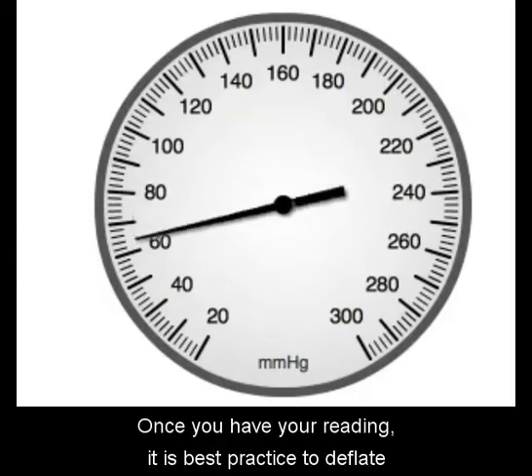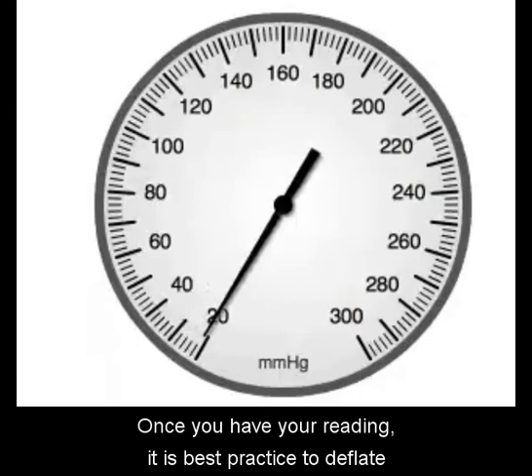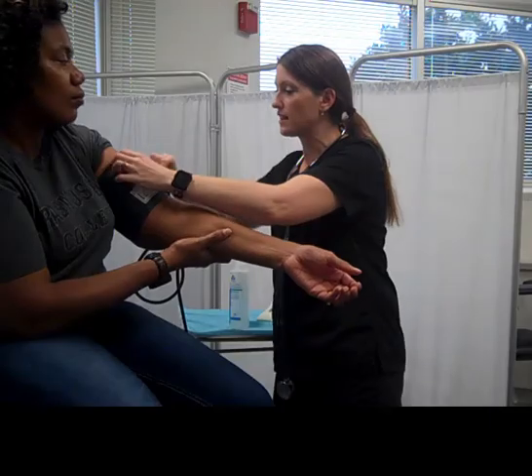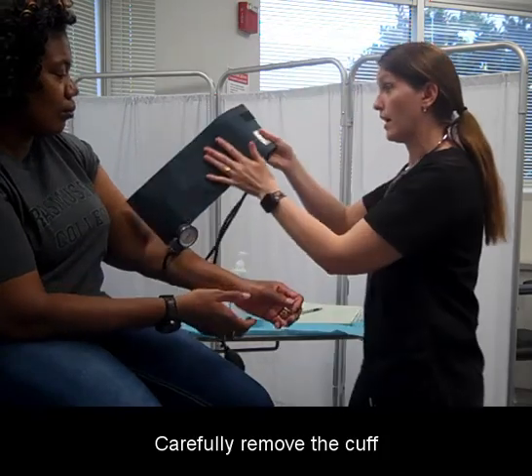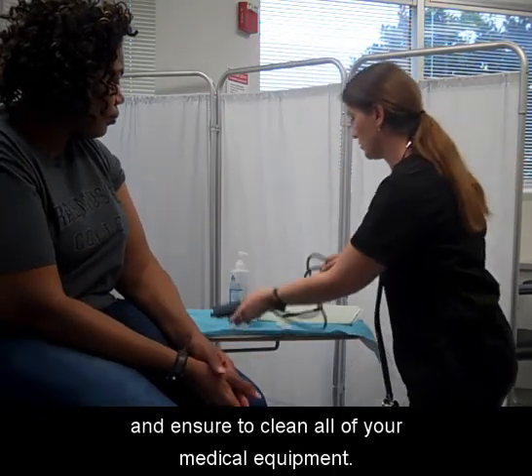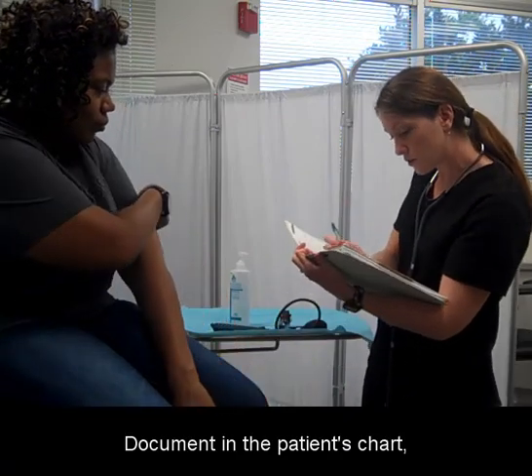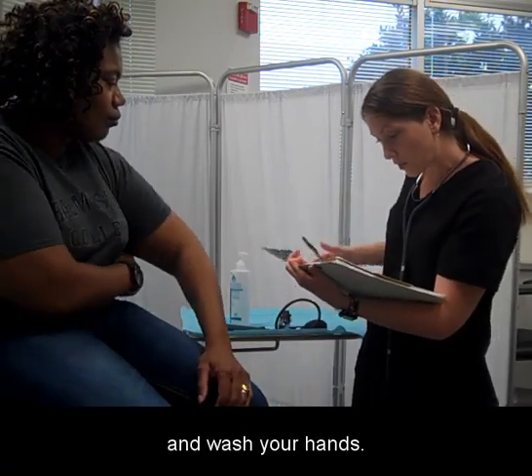Once you have your reading, it is best practice to deflate and begin to take the cuff off the patient's arm. Carefully remove the cuff and ensure to clean all of your medical equipment. Document in the patient's chart and wash your hands.